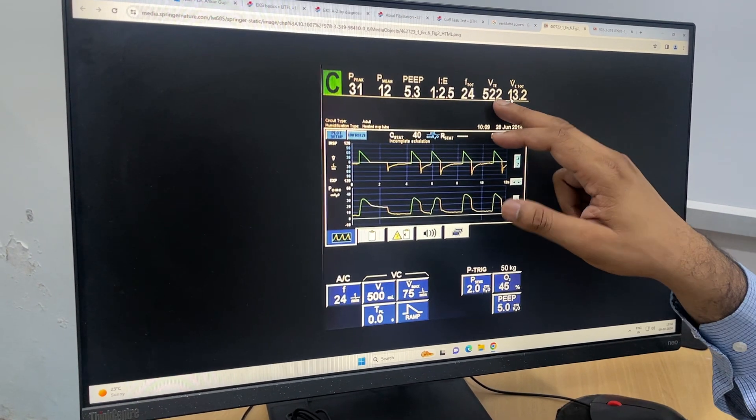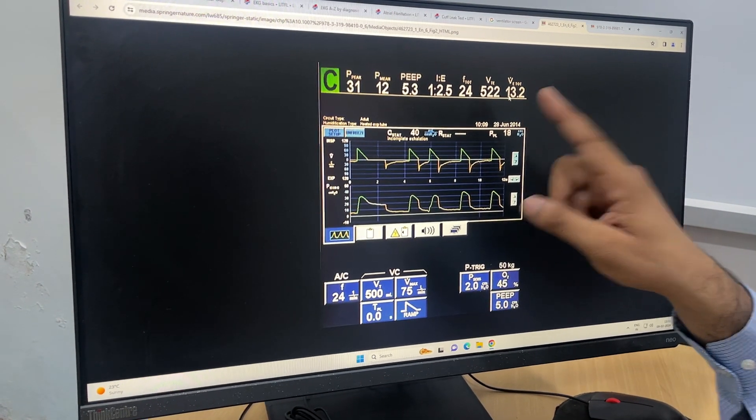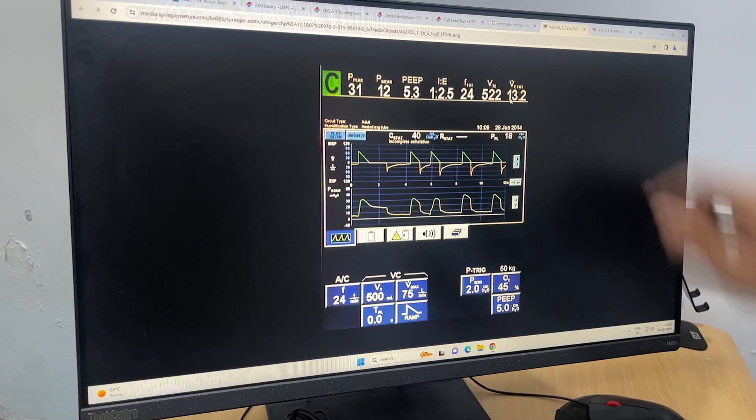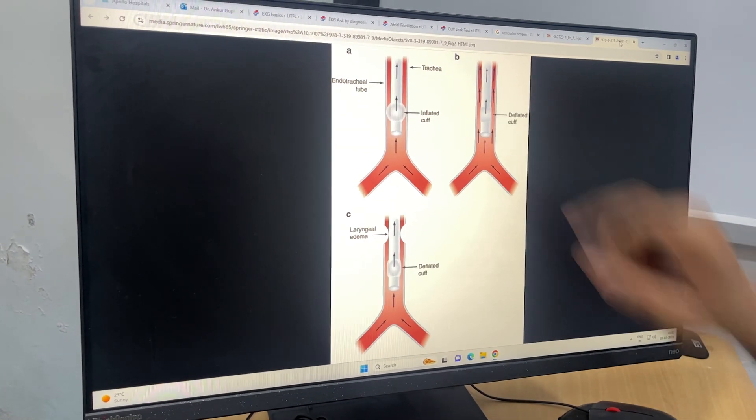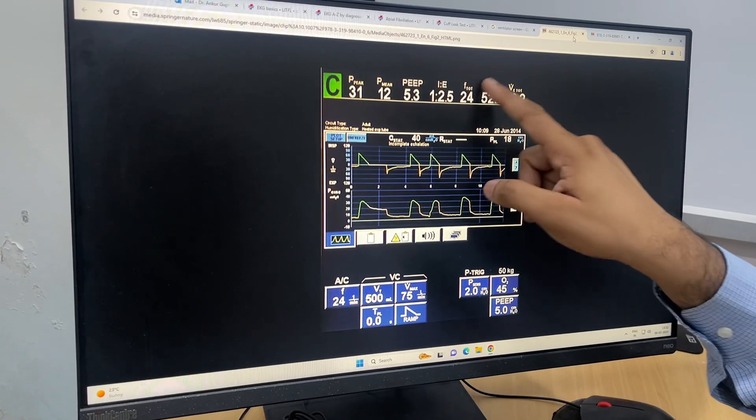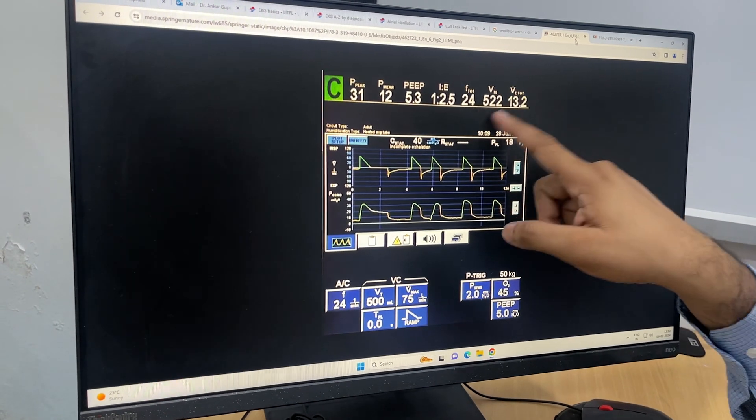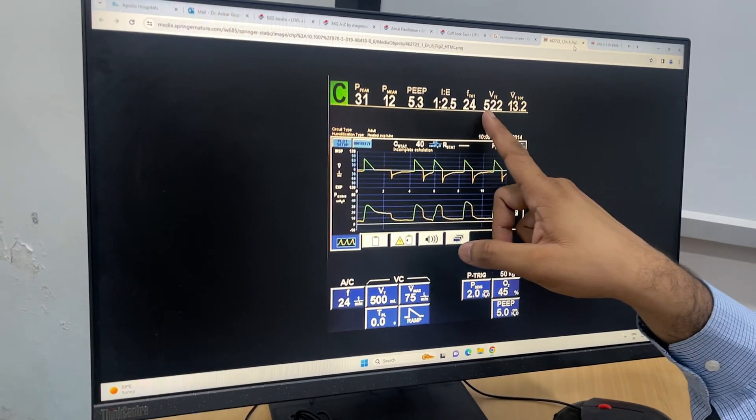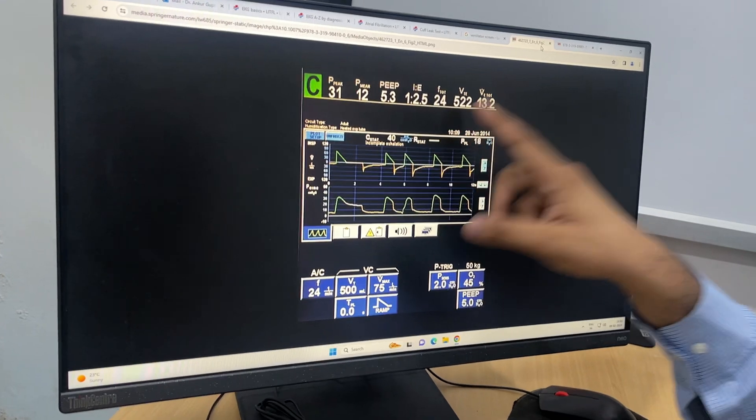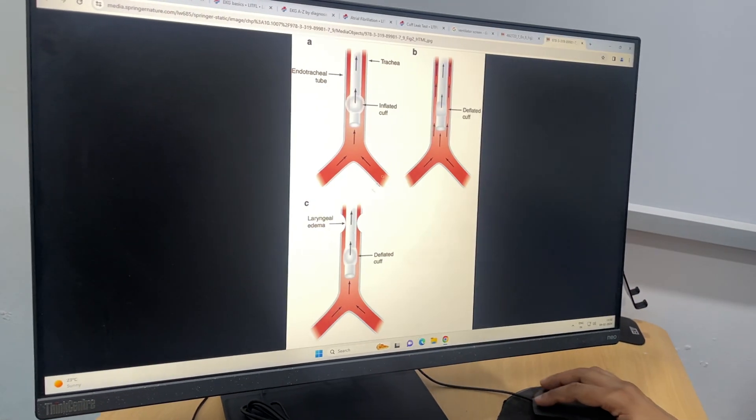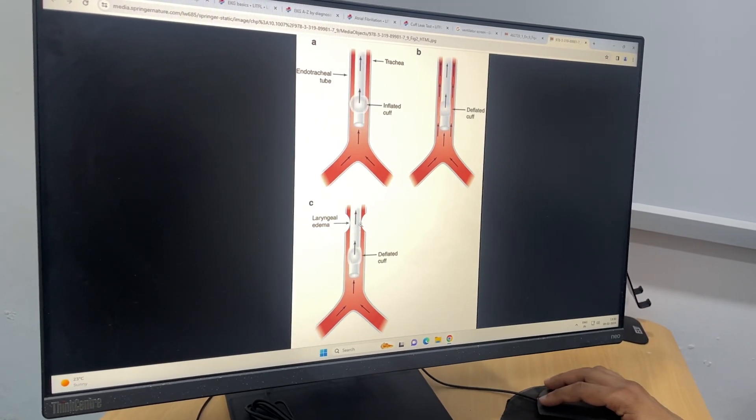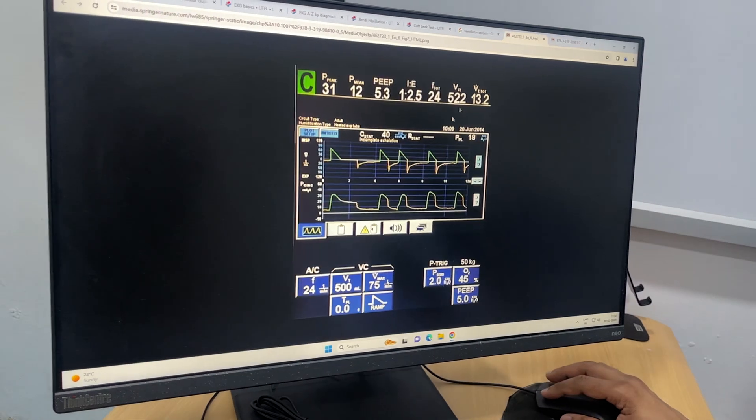Now, in a normal patient there will be a leak—the air will leak from the side walls. The ventilator will show that the expiratory tidal volume has leaked, and it will come around 300 or 350, like that.